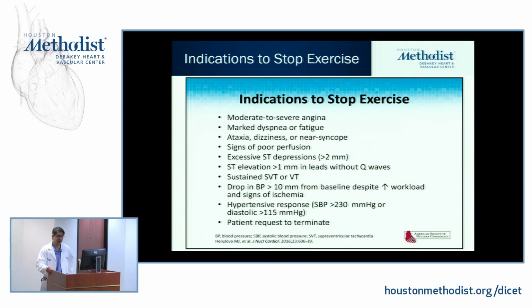When you are exercising them, it's often a question, what should I do? Should I let them go? Should I just stop it when they reach their target heart rate, or should I keep on going? Preferably as cardiologists, we want you to let them go as long as they can, because to be honest with you, we learn so much about them, how much they're able to exercise, what are the symptoms that stop them. So for us, we prefer that these patients should be exercised until they stop.